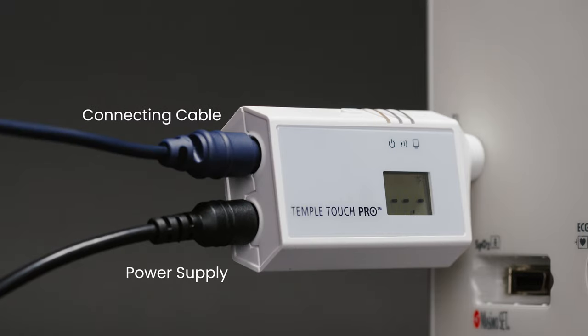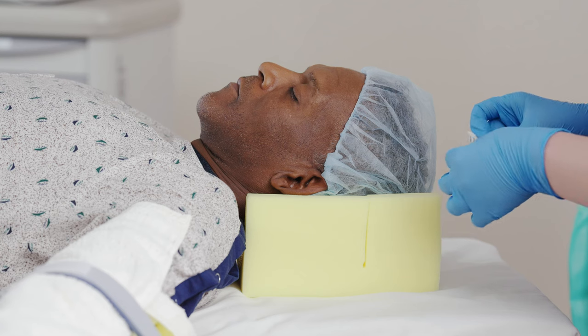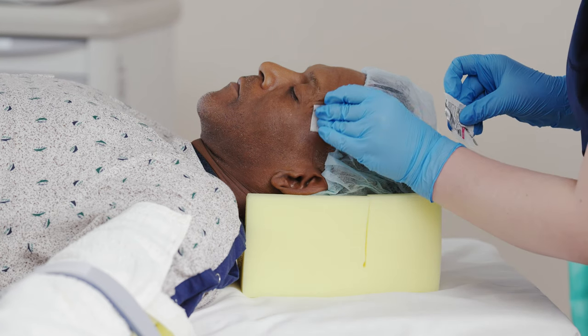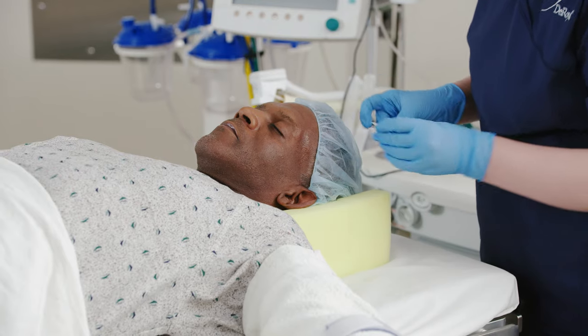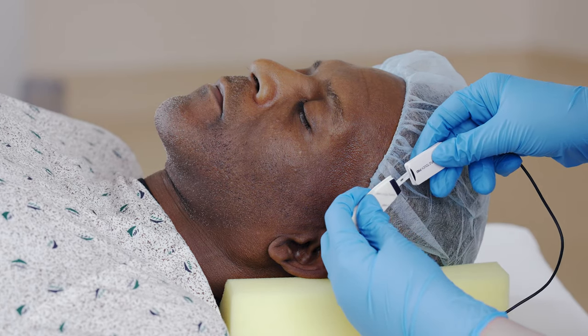Connect the cable to the MCU. Use an alcohol wipe to clean and disinfect the patient's temple, and allow the temple to dry completely prior to sensor application.